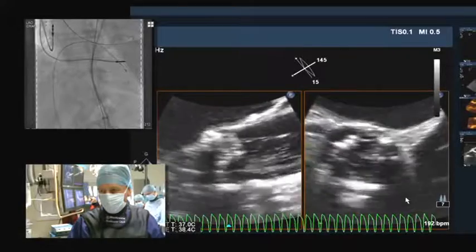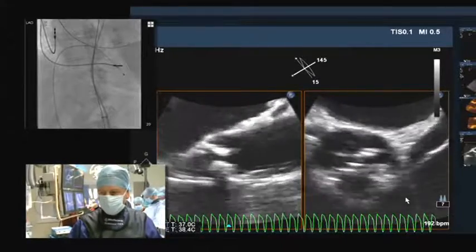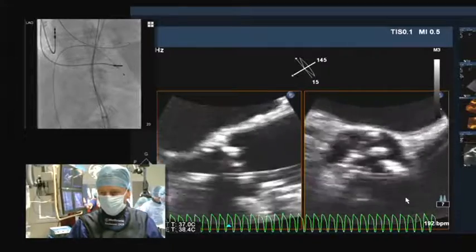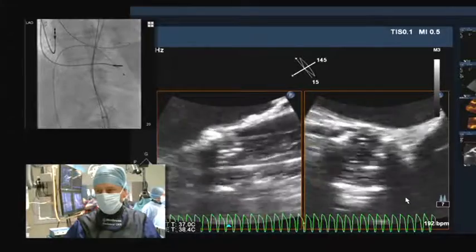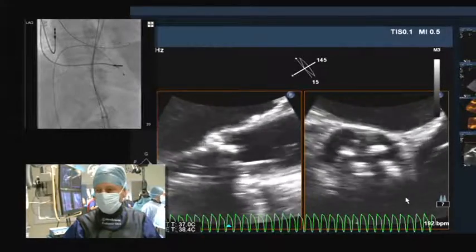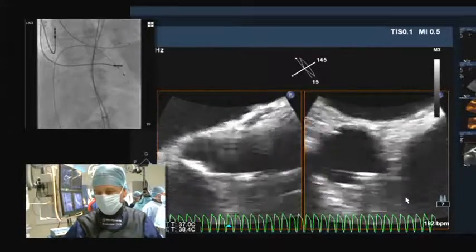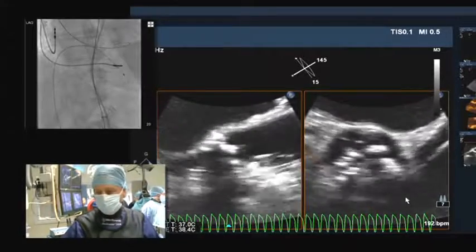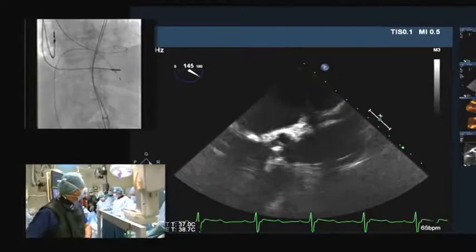You can see here we're inflating with a 20mm balloon, and that seems fine. There's enough space in the sinuses for those valve leaflets, bearing in mind that we're going to need to allow about another 1 to 2 millimeters either side, because the valve will be another 3 millimeters in diameter when it's deployed. Okay, Raf, you manage the wire.